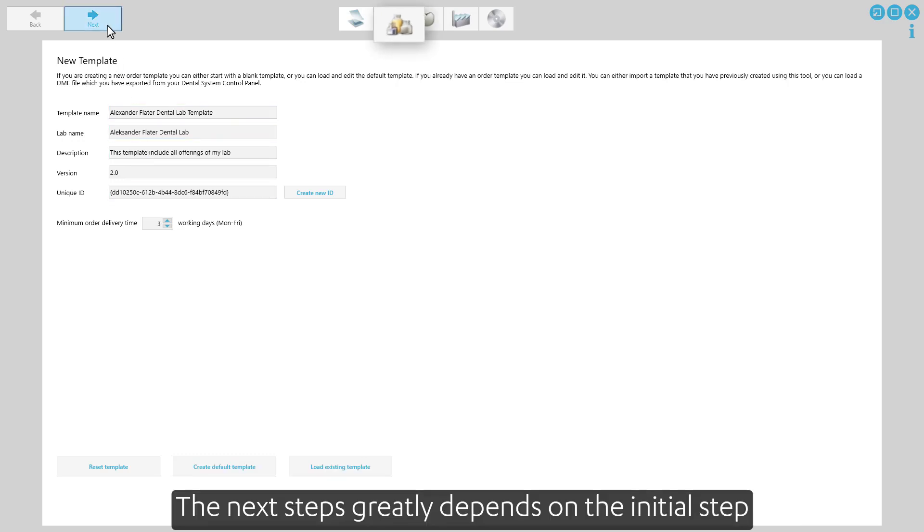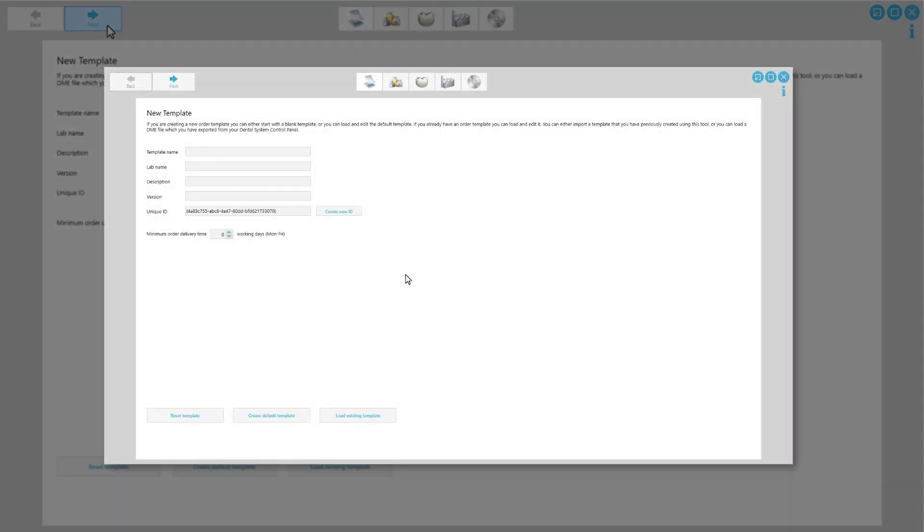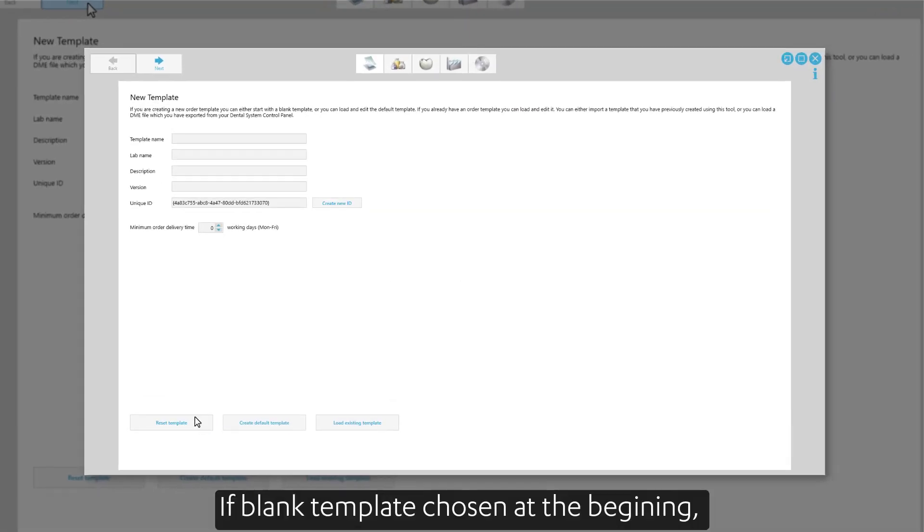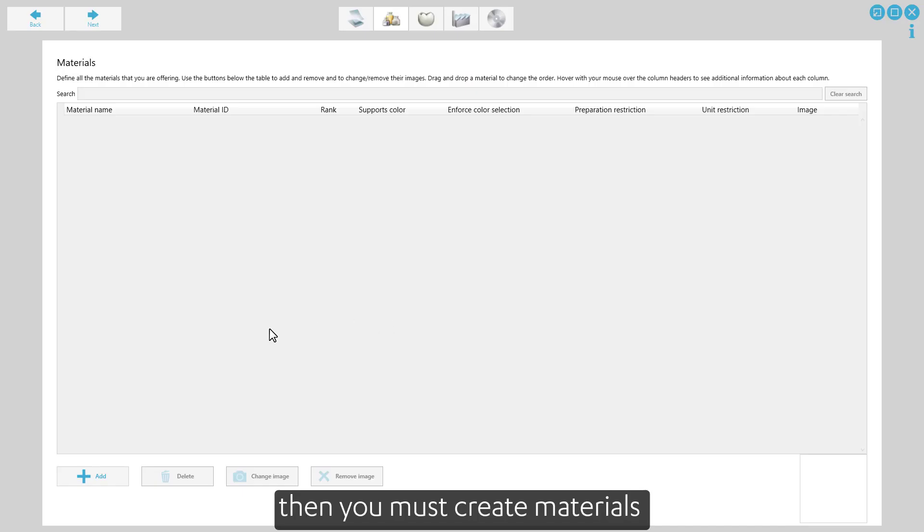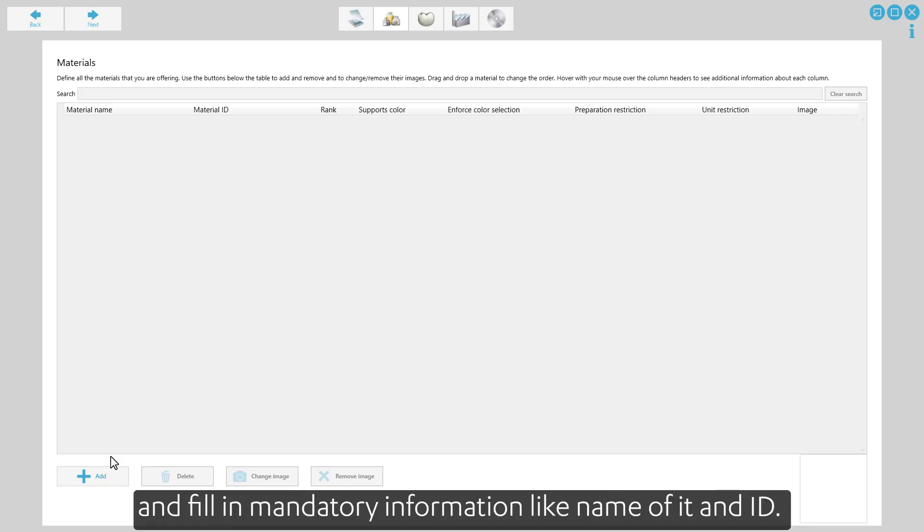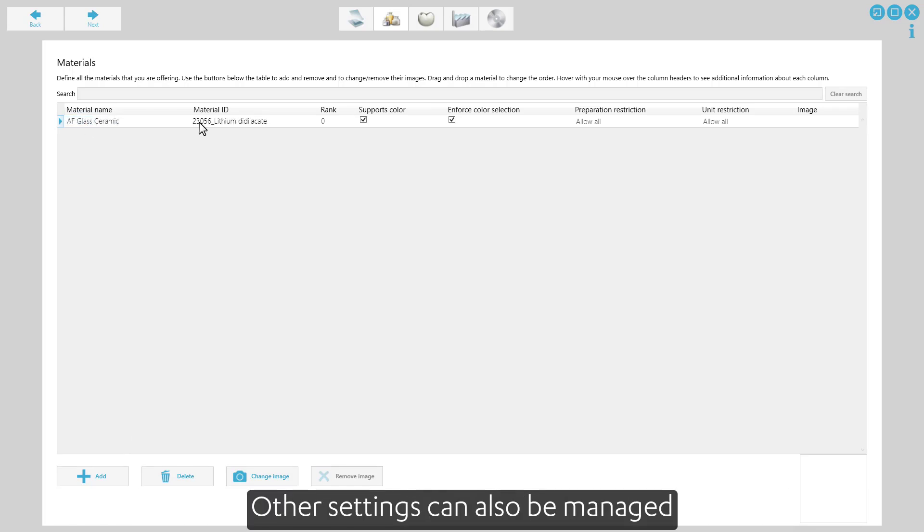The next steps greatly depend on the initial step. If a blank template was chosen at the beginning, then you must create materials and fill in mandatory information like the name of it and ID. Other settings can also be managed.